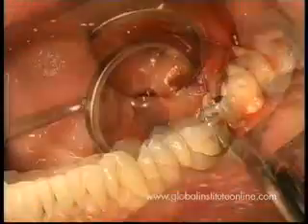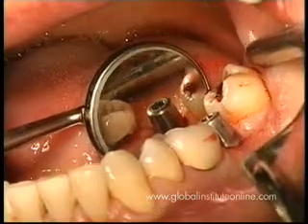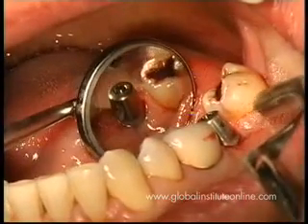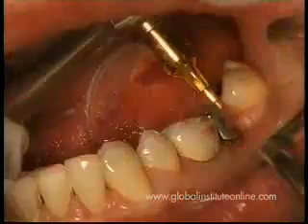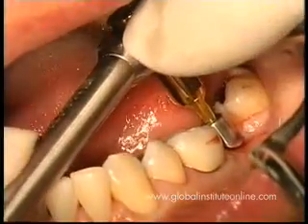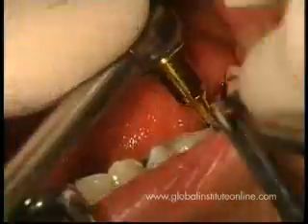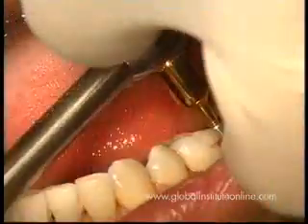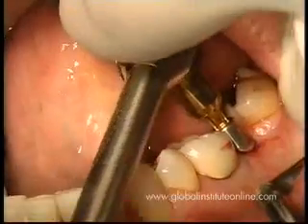That's what we need for an immediate temporization. Important here to demonstrate that the implant is seated fully, that the threads of the implant are in bone, and that this implant as well is going to be in a position that there is no interocclusal space interference.